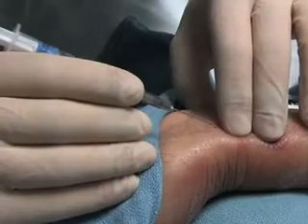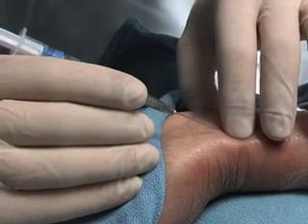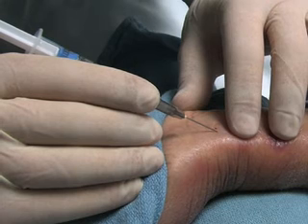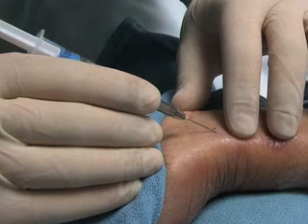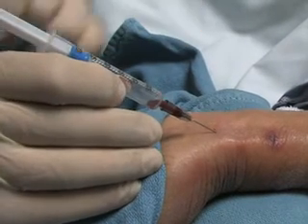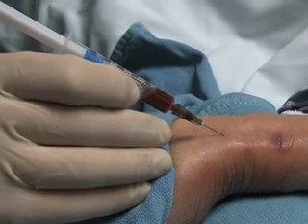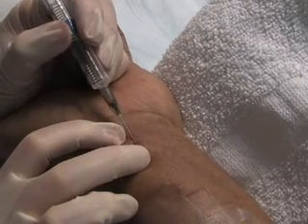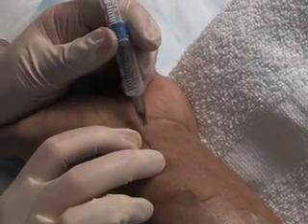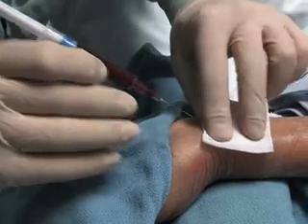Again, locate the maximum impulse with the index and middle fingers of the non-dominant hand. Holding the arterial blood gas syringe with the dominant hand, aim the needle away from the hand and toward the upper arm, and puncture the skin at a 30 to 45 degree angle at a point just below the index and middle fingers of the non-dominant hand. Advance the needle slowly until the syringe easily and passively fills with bright red pulsating blood. Ideally, you should obtain at least 1 to 2 cc's of blood. If no blood is obtained, do not pull back on the plunger. Withdraw the needle slowly until it is just under the skin and re-attempt the procedure. After the blood sample is collected, withdraw the syringe and have an assistant apply pressure to the site with sterile gauze for approximately 5 minutes.